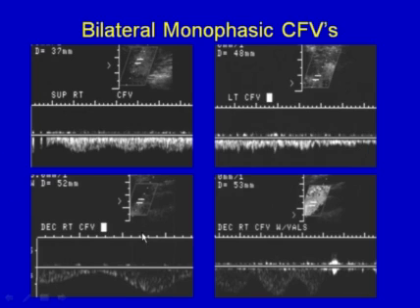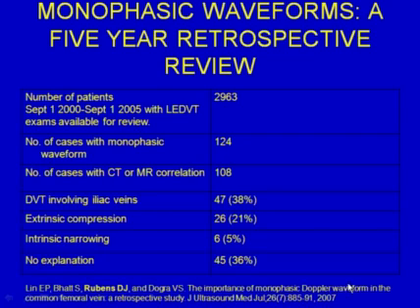In this patient, we changed the position. You can see here it says decubitus right common femoral vein, and you can see that the pulsatility and the variability came back. And here with the Valsalva, you can see a good obstruction, if you will, of the waveform as the patient holds her breath. And this is a patient who was pregnant. So the weight of the uterus basically was compressing her IVC as well as her iliac vessels. And so when we turn her off of her IVC onto her left side, we can restore the flow in her veins. So how significant is this as a clinical problem?